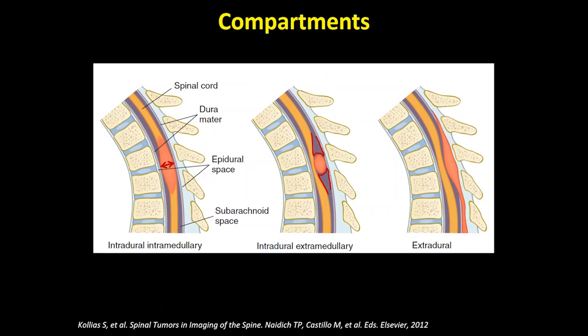And if the extradural compartment is effaced and replaced by the lesion, then you place the tumor in the extradural compartment. So let us start with intramedullary tumors.